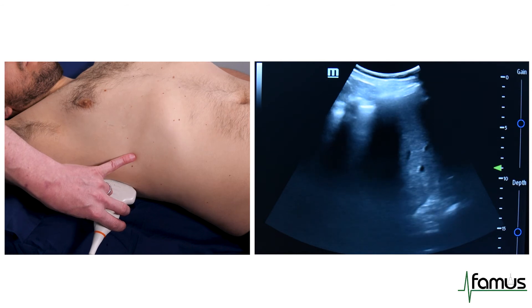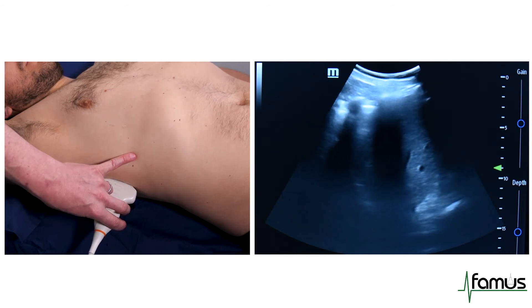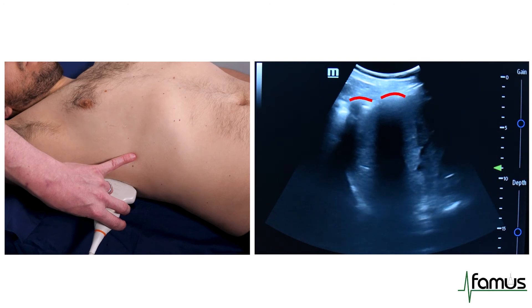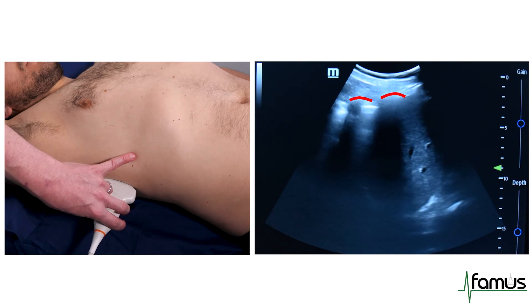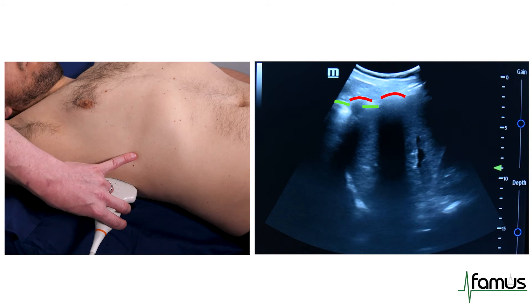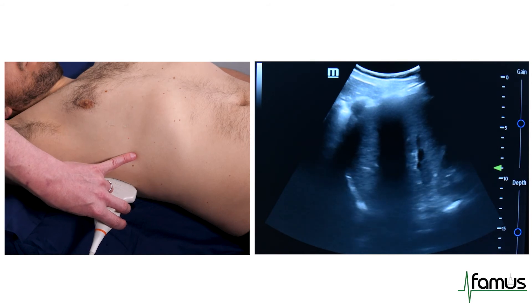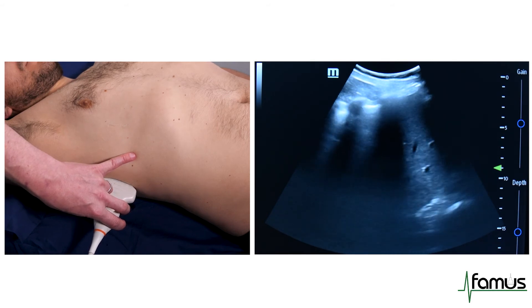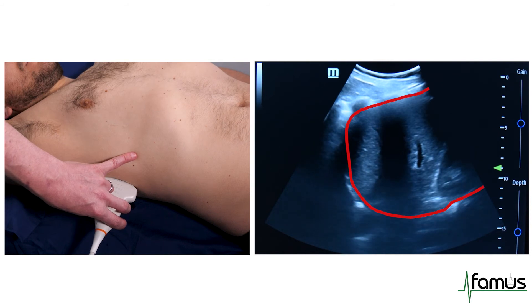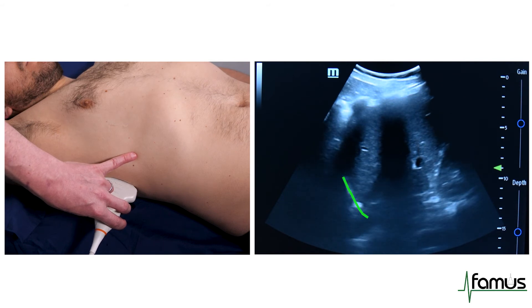In this scenario we get an image similar to what's generated on the screen — you can see the ribs casting a shadow again. You can see the pleural line coming in from the left, but now in the centre and the right of the picture you can see the liver, with the base of the diaphragm just at the bottom of the picture.